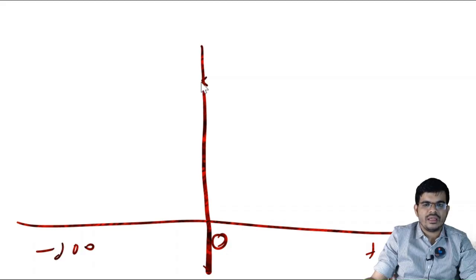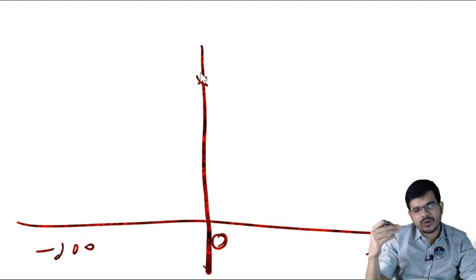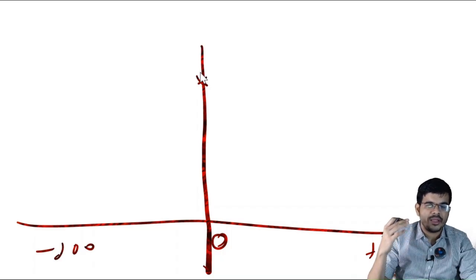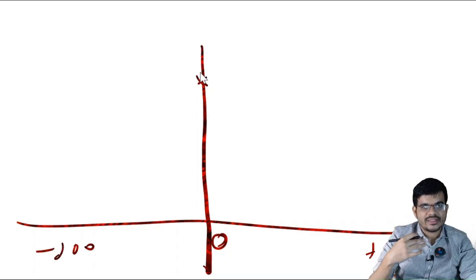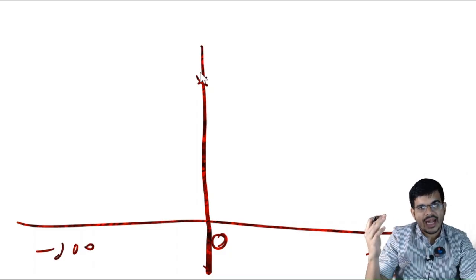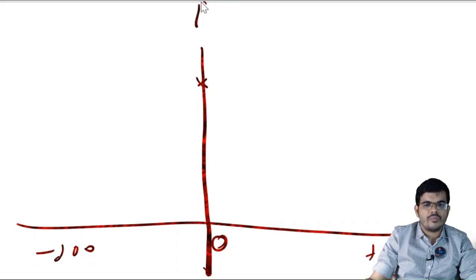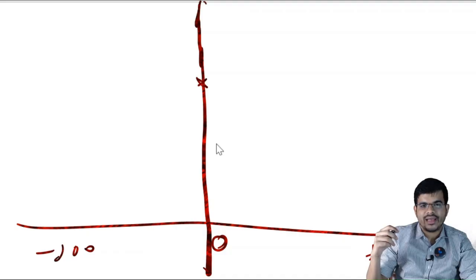When the pressure on either side of the tympanic membrane is the same, the compliance will be the maximum. That will happen if the eustachian tube function is normal and if you are not giving any external pressure. So we can keep this as the point of maximum compliance. It will be nearly at the half of the y-axis. This point is usually seen.